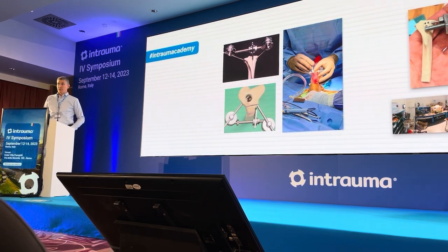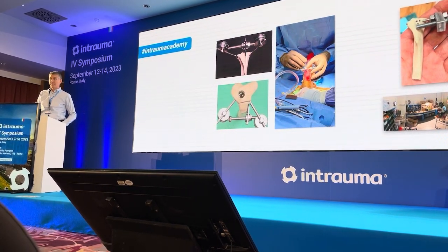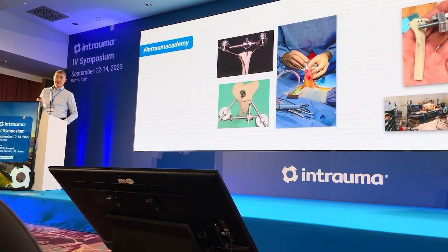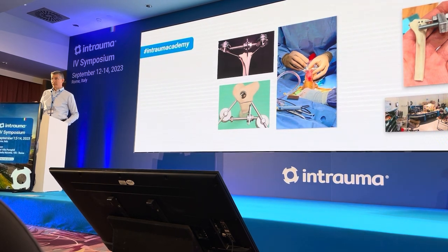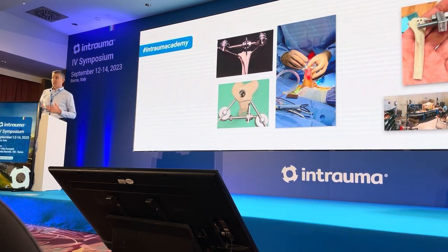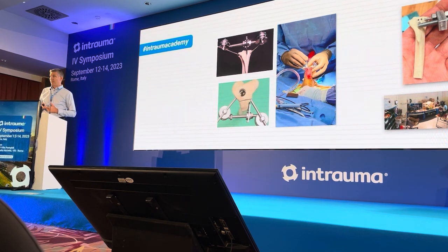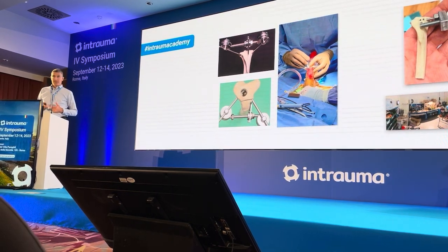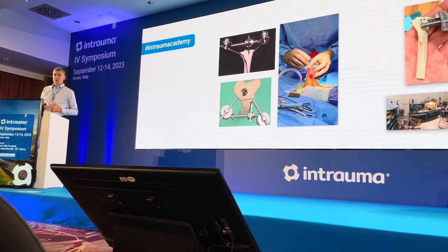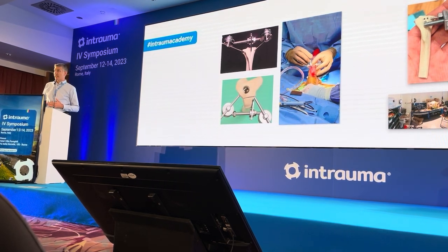In my hands, the original TTTT tool and technique was a successful technique for my patients to allow for rapid bone healing, early return to function, as well as decreased implant-associated complications. With that said, there are some surgeons that found it technically challenging to place two pins with the original tool, especially in tiny patients. In those patients, it would often require small pins at 1.8 millimeters, which can bend, and so it also limited the size of the patients that we could use this tool and technique for.